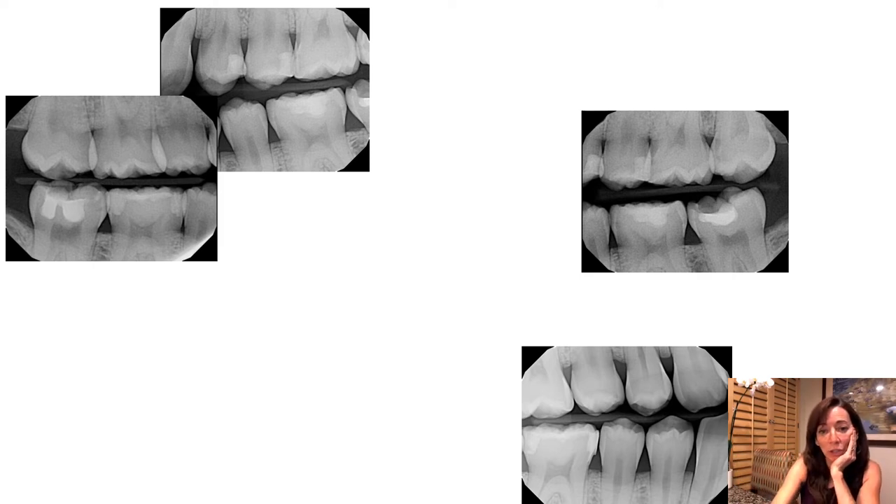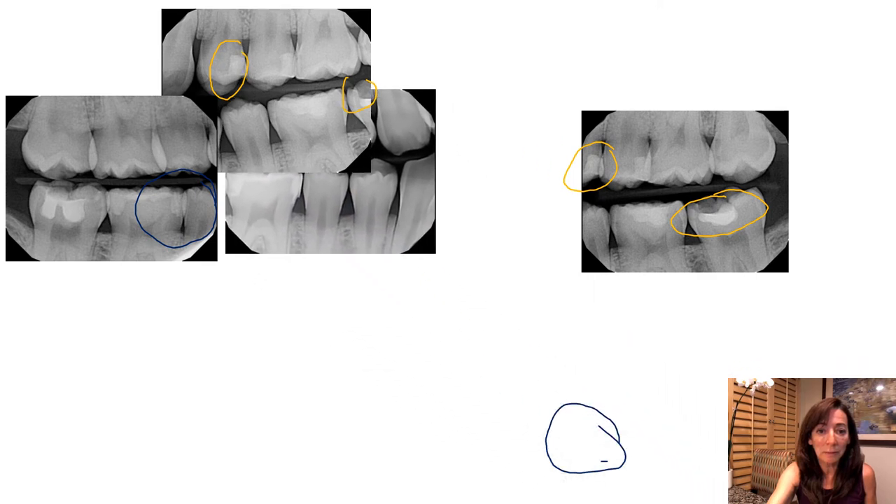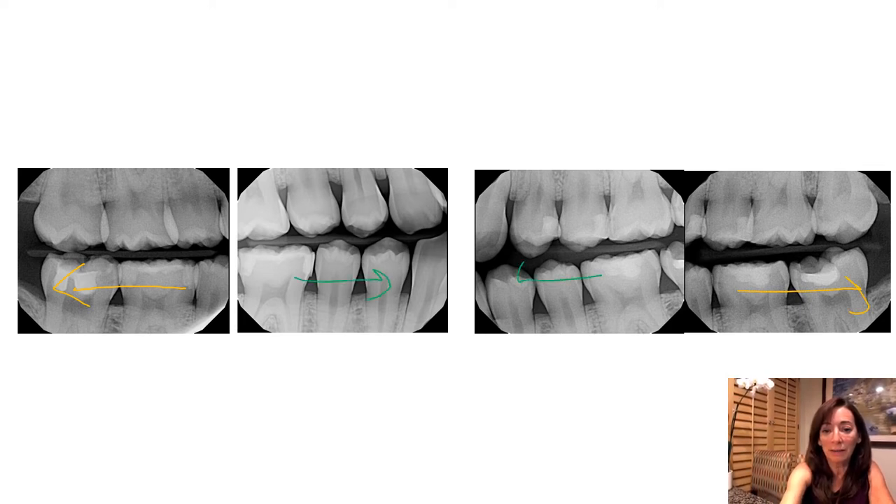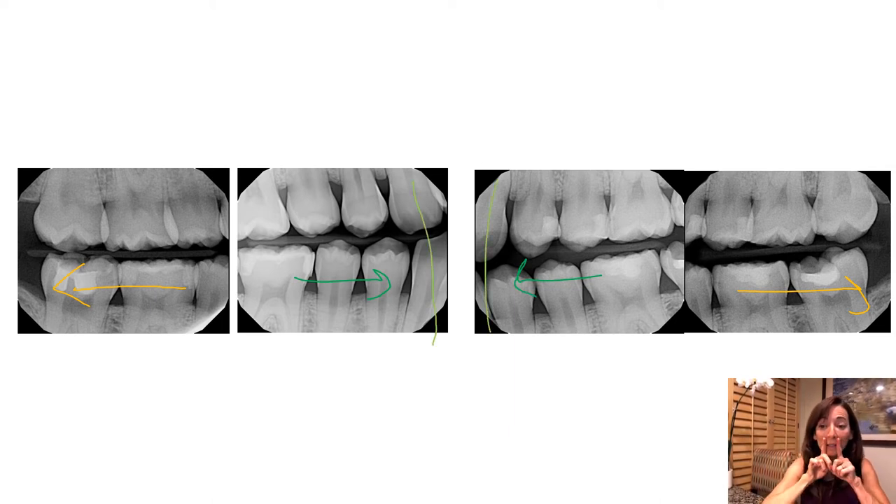Now we have to decide which side our premolar images are going to go to. You can see this little cavity right here — just a little hint of it. And here's another clue: here's a little filling, and here's that same filling right there. On the other side, we have this filling here — you can get a better picture of it here. You can see those images set in line: molars on the outside, premolars toward the midline. Can you see the canines here? Clearly the canines are farther forward.